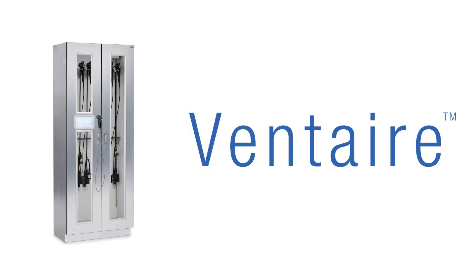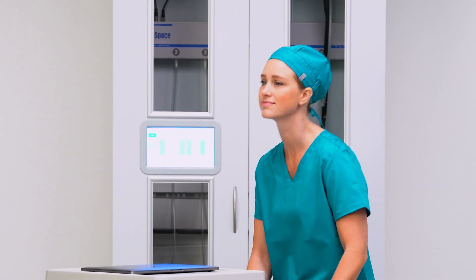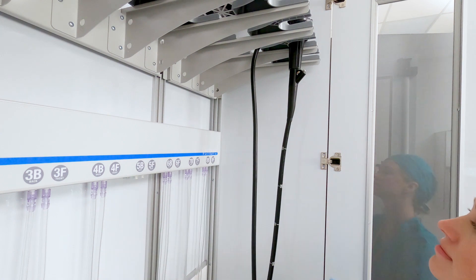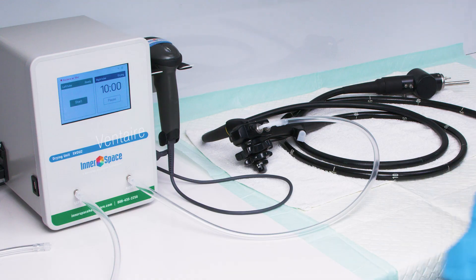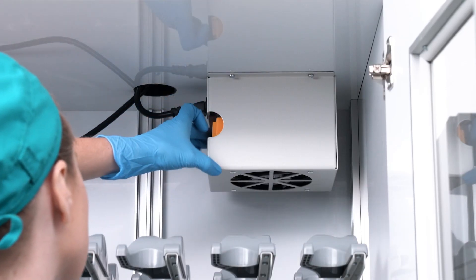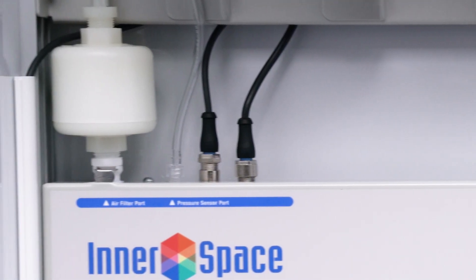The Ventaire system from Innerspace includes products that assist endoscopy staff in the safe and thorough drying, tracking, and storage of reprocessed scopes, including Ventaire drying and tracking cabinets and Ventaire drying units. Both products provide consistent and continuous delivery of HEPA-filtered, pressurized air into endoscope channels to keep scopes dry.